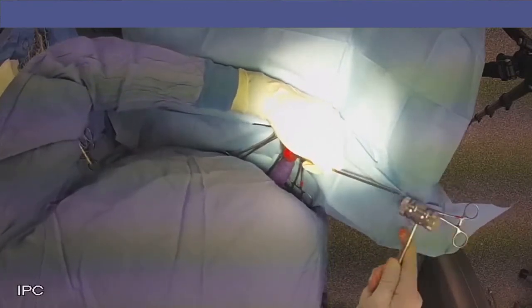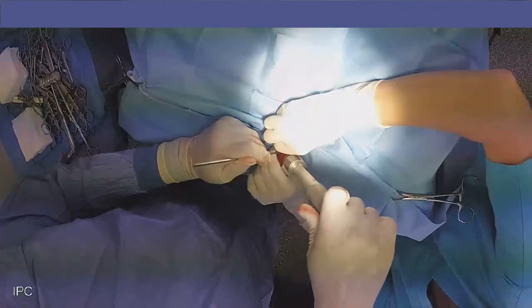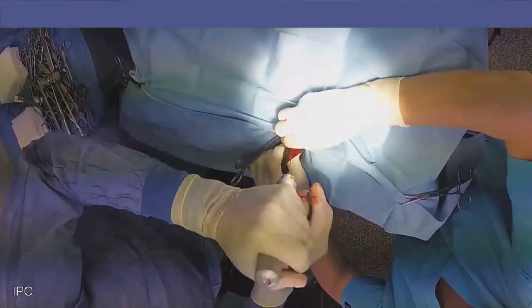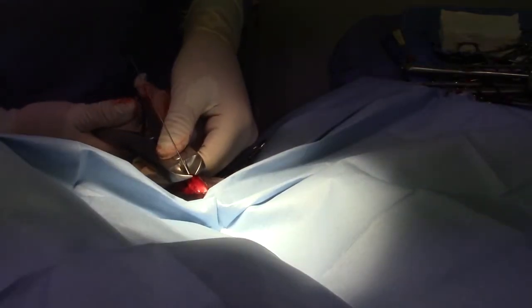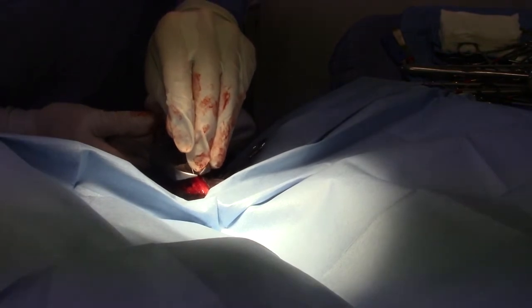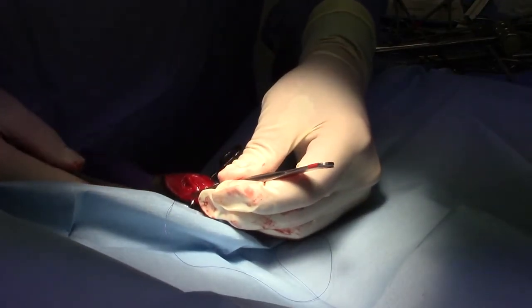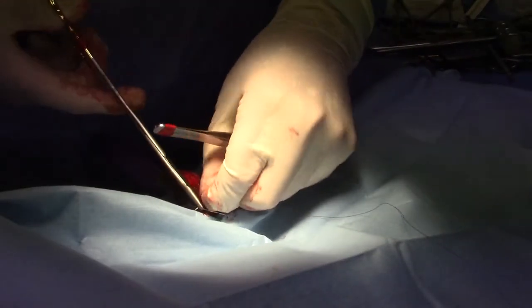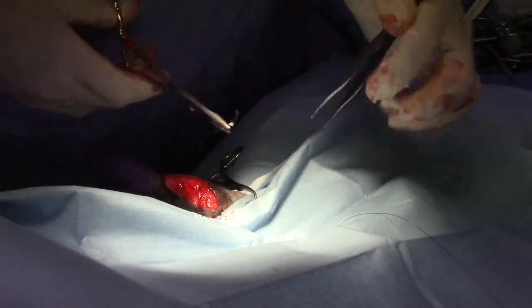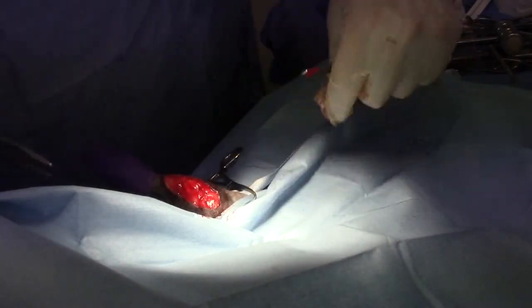The tibial tuberosity sits just below the joint, and its purpose is to give a place for the patellar tendon to insert. The whole reason this happened in the first place is because that tibial tuberosity is in the wrong spot. So we dislodge it with an osteotome, move it over to where it's supposed to be, and hold it in place with a small Steinman pin. Now I'm taking my triangular piece of fascia lata and effecting the joint imbrication as planned — that's the third procedure in the trio.